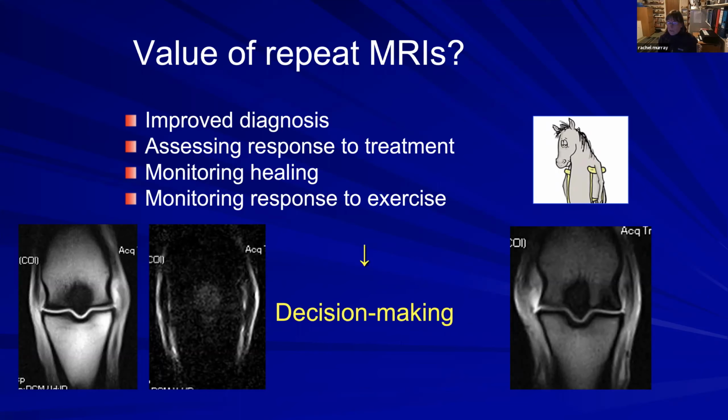I've seen it in horses doing a variety of different sports, and I think the endurance horses, as you say, is probably because we've MRI'd them an awful lot, because they are a population where there is concern about catastrophic injury and concern about severe pathology, and they can afford to do it, so they do follow them very closely. But I've seen it not just in endurance horses.